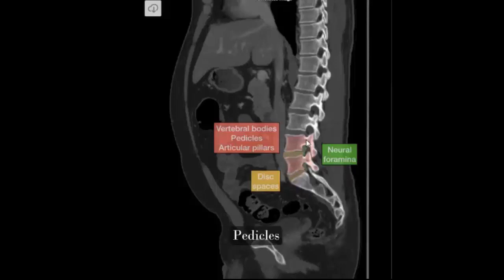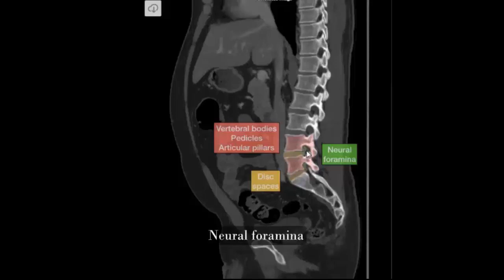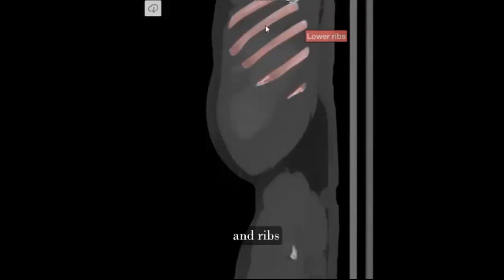Pedicles, articular facets, neural foramina, and ribs.